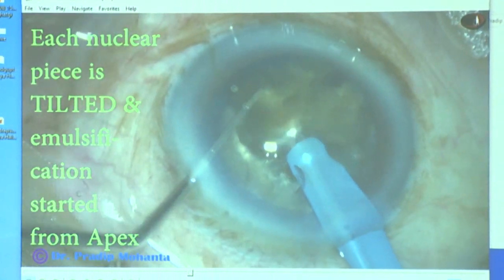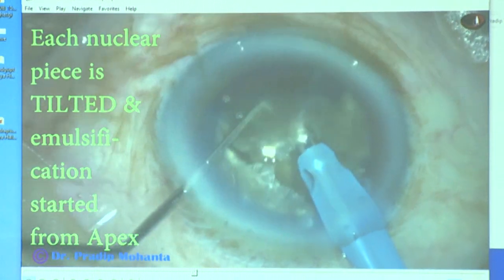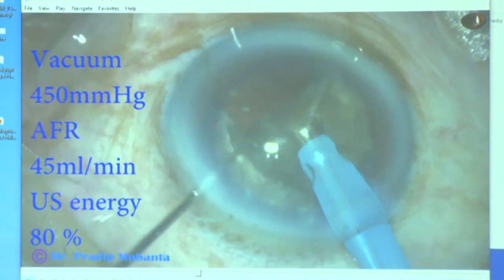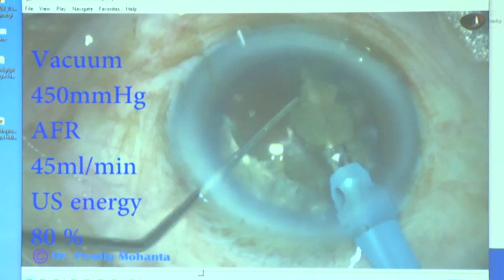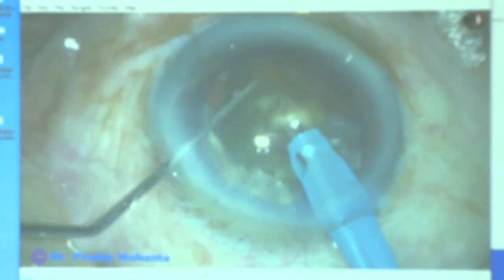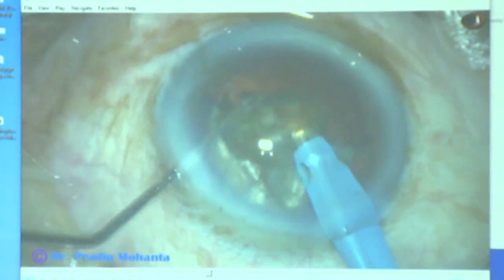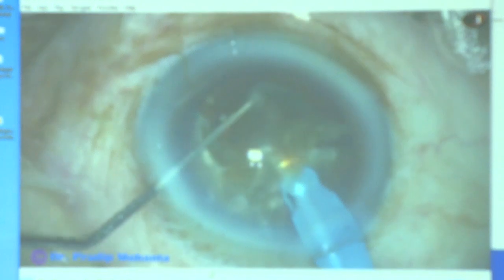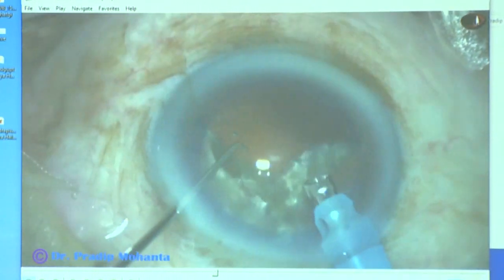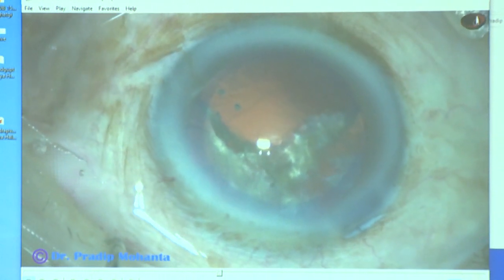Ultrasonic energy is 80%, flow rate is 45 ml per minute, vacuum is 450 millimeter of mercury. The machine is not a very high-end machine, it's an Oertli Catarhex 3 machine. And with this machine, I can manage most of the hard cataracts. And I have no financial interest, but most of the ophthalmologists cannot afford a Centurion. So with a mid-range machine, we can manage hard cataracts.